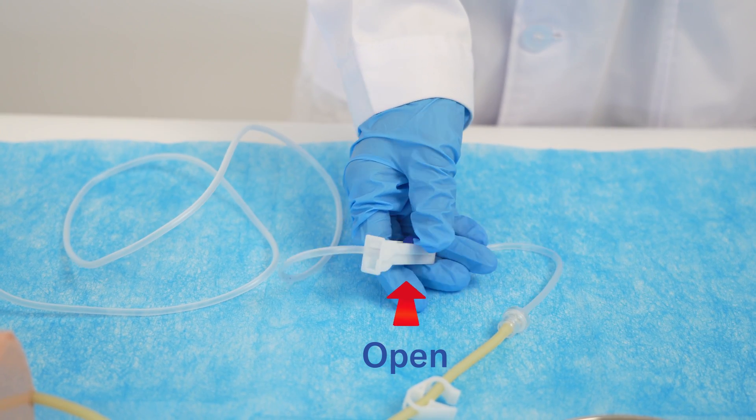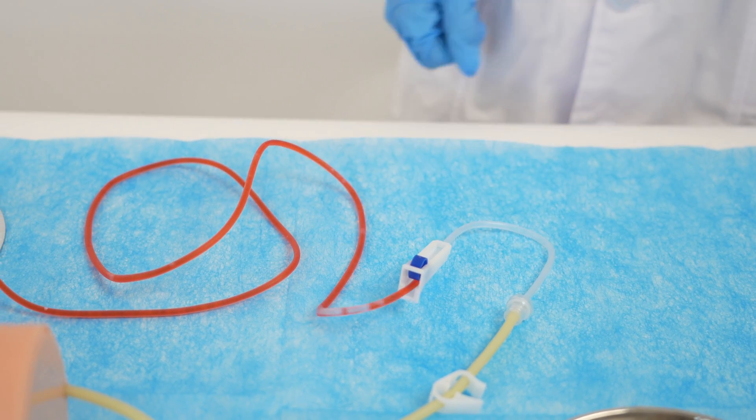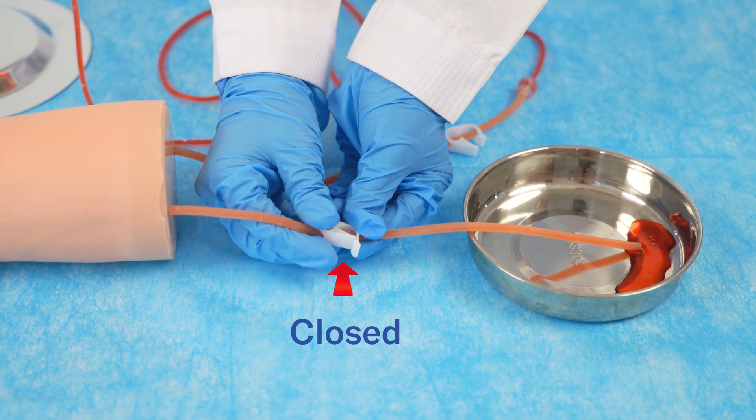Once the mixture is added, open the outflow roller clamp and let the fluid flow through the tubes until all air bubbles are expelled. Afterward, close the clip clamp at the exit of the arm's tube.